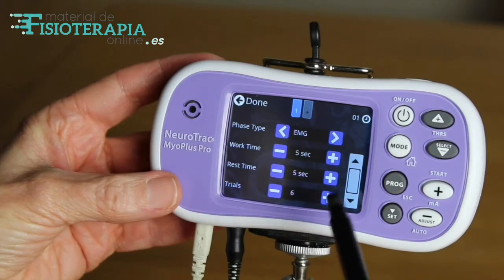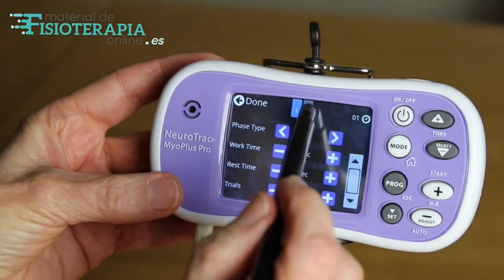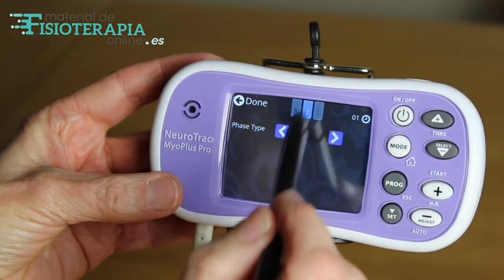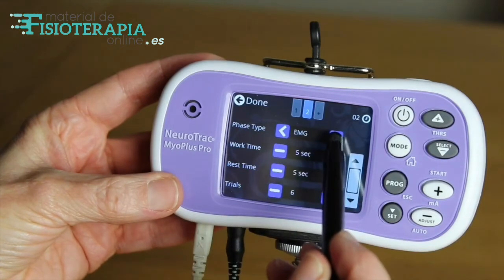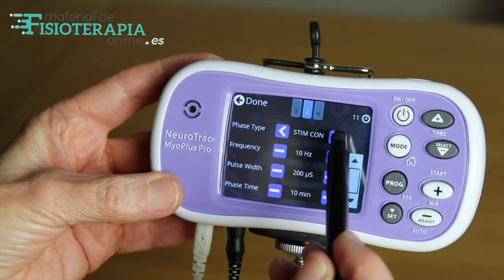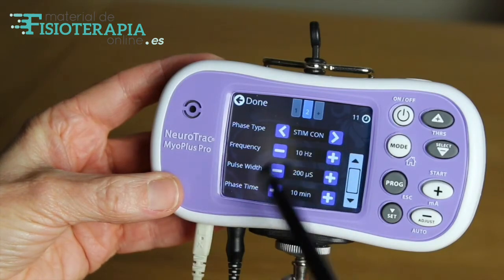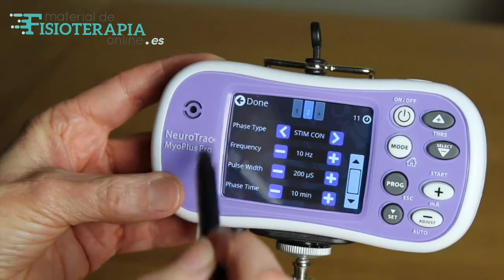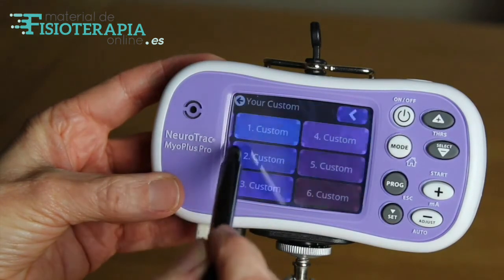It's possible to add another phase to a custom program, such as muscle stimulation, to follow on from the EMG session. This is done by adding another phase to the sequence — for example, here I'm adding another stimulation session. In total, five phases can be added to each customised program.